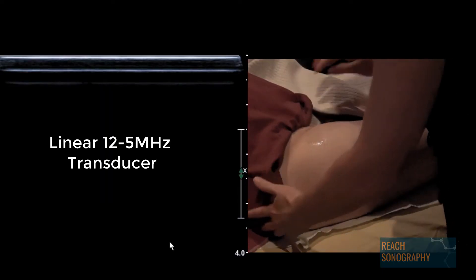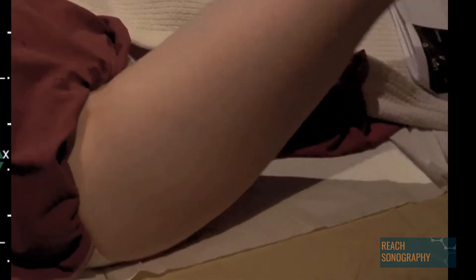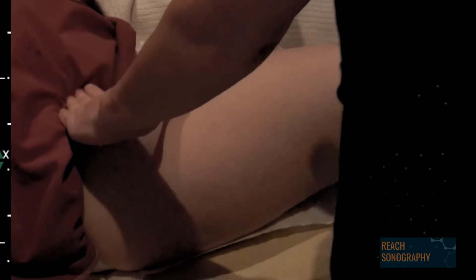It's good if you can coach your patient how to do it first. The first position is hip flexion — I just call this tabletop. Then you're going to have to try and find the tendon, come out to the side, get them to pause, and then they do one big circle like that. Try to palpate it so you'll feel the click under the transducer, which is helpful.